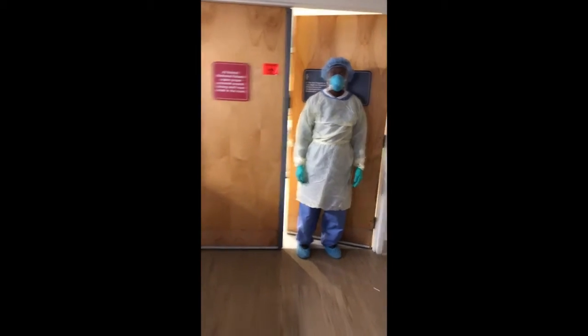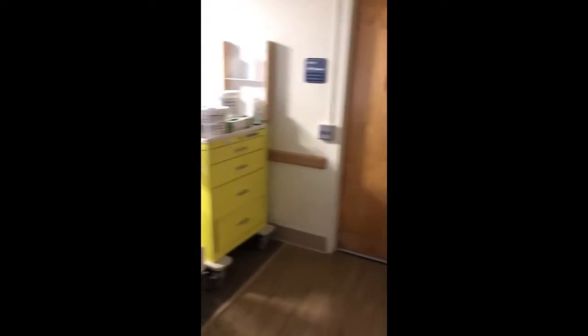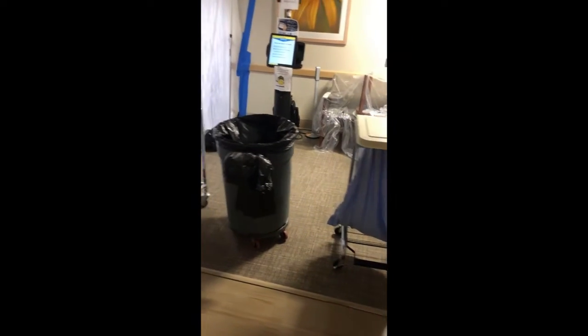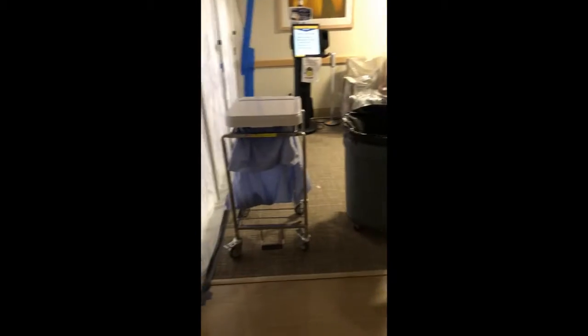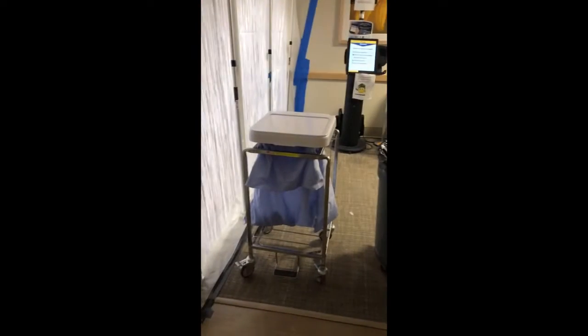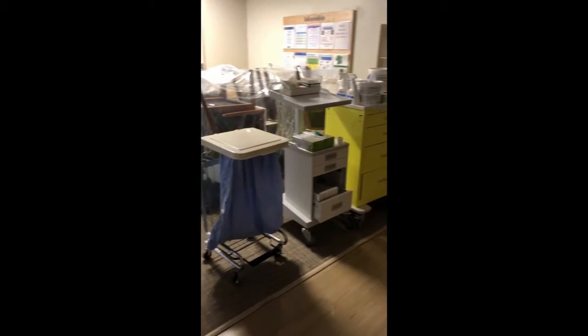Once you're done with the patient, you're going to come out of the room. This is the ante room where you're going to doff your protective gear. We have station one right here, right next to the trash can, and station two. If there are two techs, they will not be right next to each other while they are doffing their equipment.